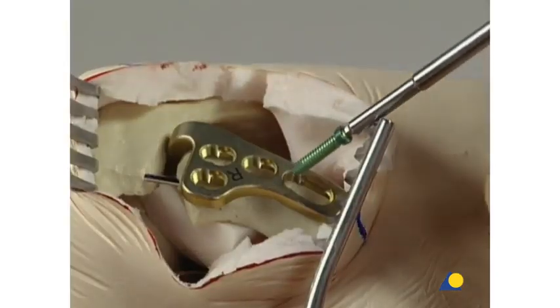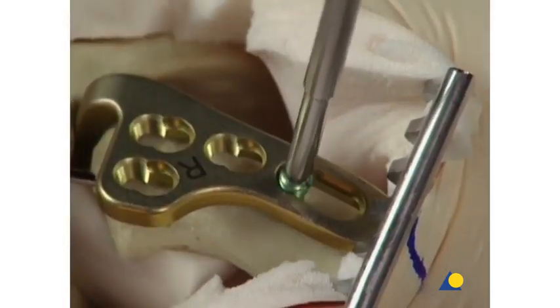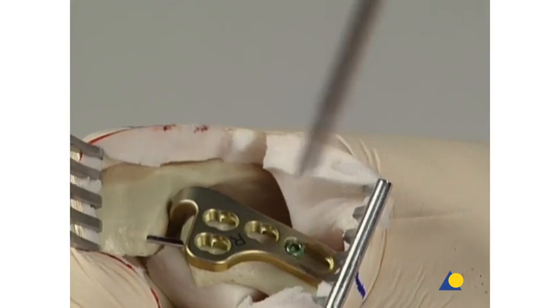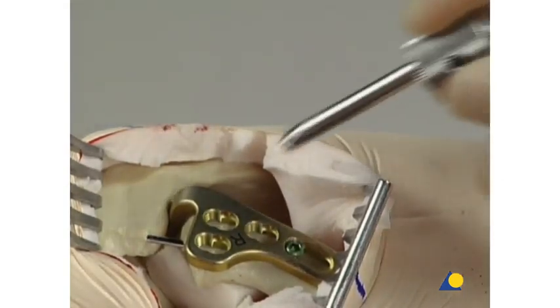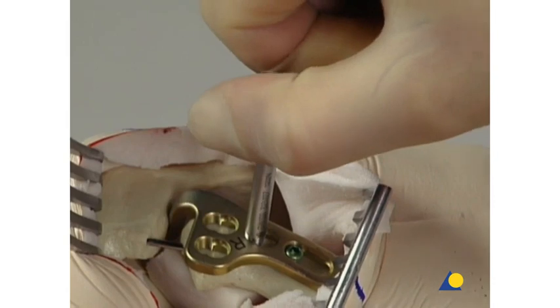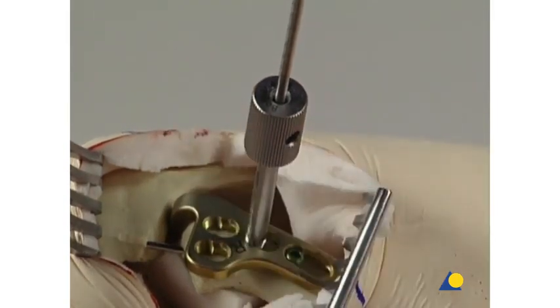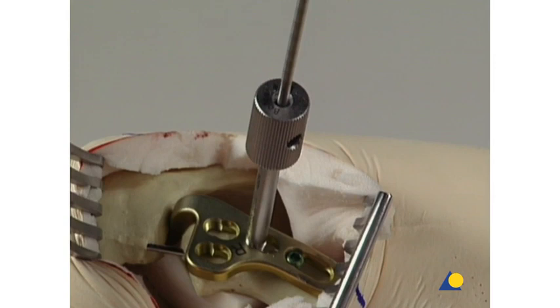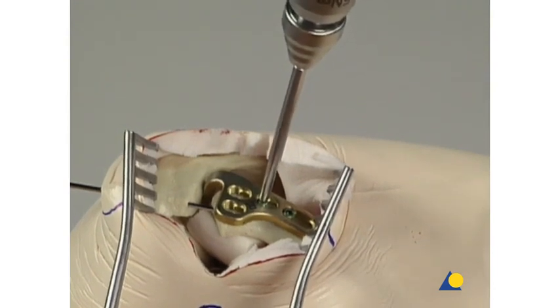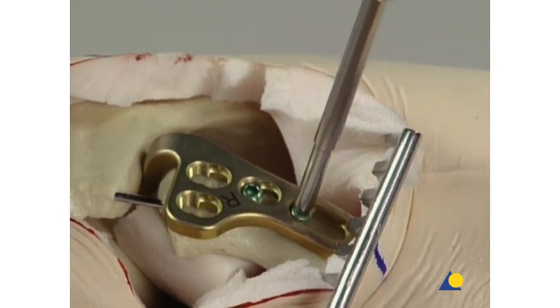The first locking head screw is inserted with the hexagonal or star drive recess screwdriver mounted on the 1.5 Nm torque limiter. The screw is introduced either manually or with a power tool until a click is heard. If a power tool is used, the speed should be reduced when tightening the head of the locking screw into the plate. When the dislocation is acute, two screws should be inserted into the medial part of the plate to ensure a stable fixation of the implant. So the procedure is repeated for the second medial plate hole. A final check confirms that all the screws are locked. Final tightening should be done manually.